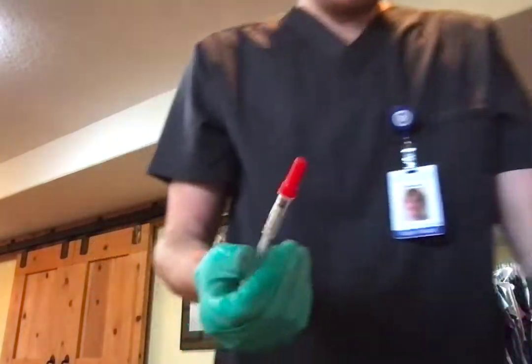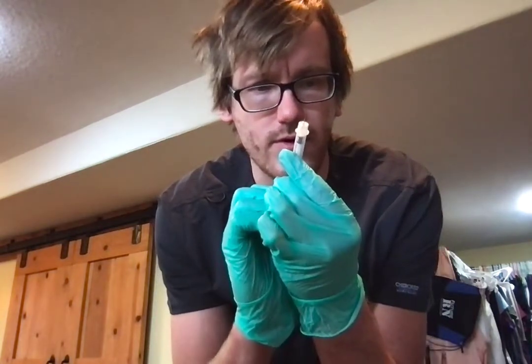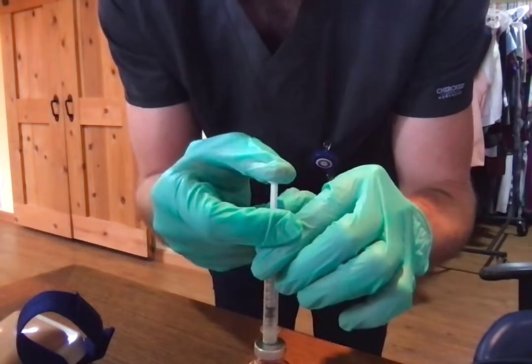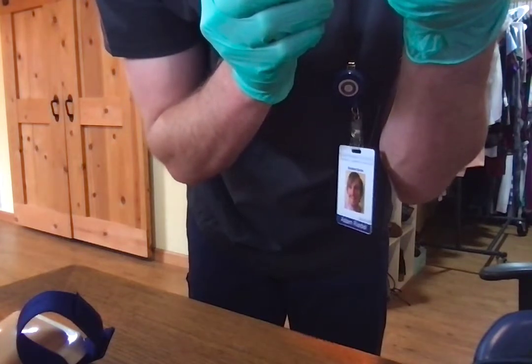ml of tuberculin. So I'm going to use this tuberculin syringe here, and I am going to inject 0.1 mLs of air, and I'm just going to try to show you guys that I got there, and I'm going to inject that into the vial, pushing the air in and then drawing up to my desired amount, which is 0.1.